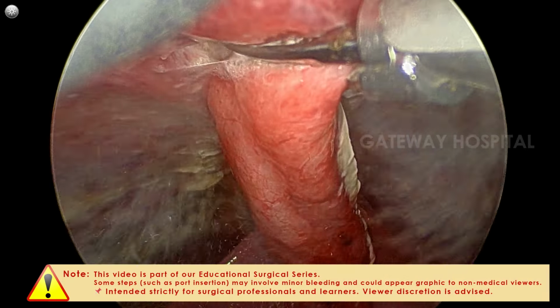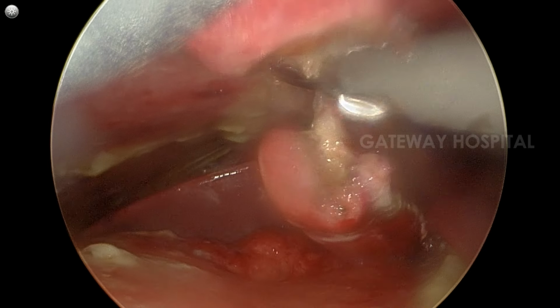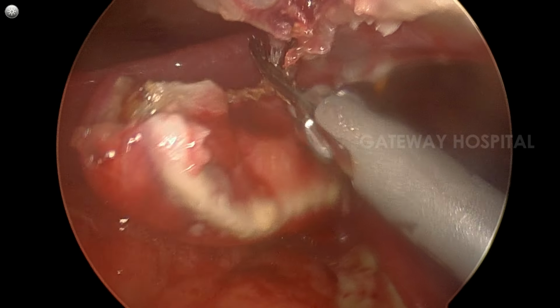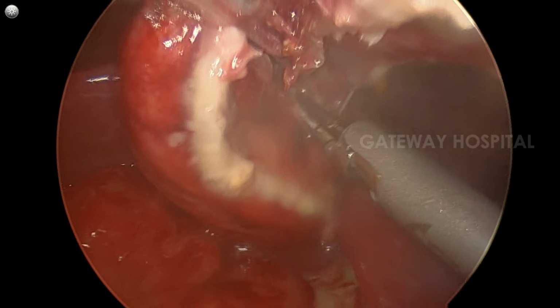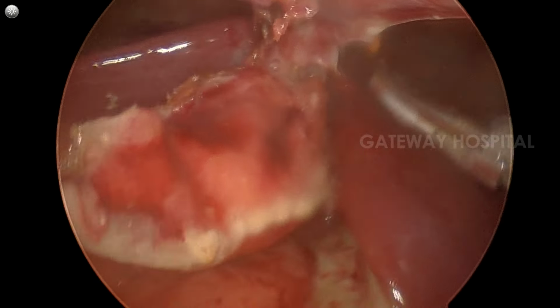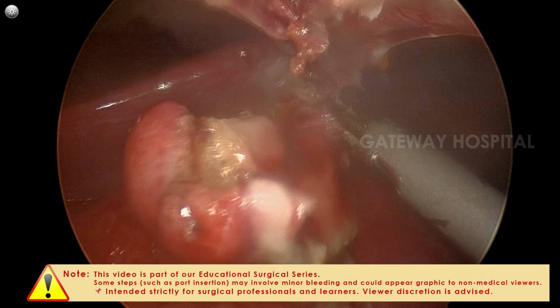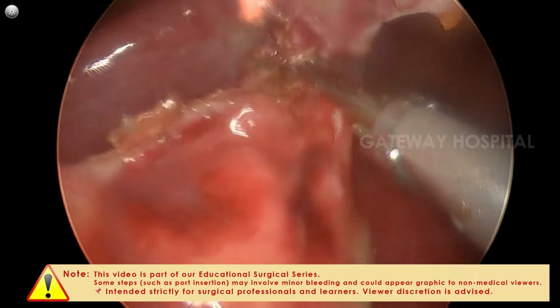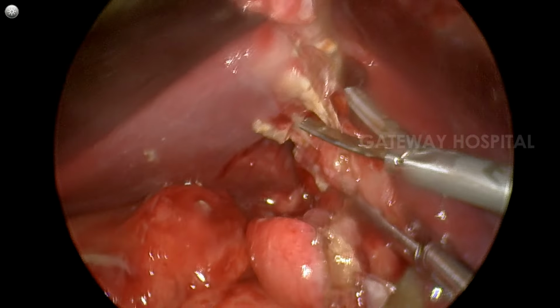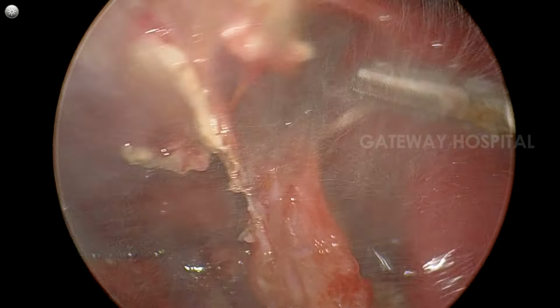Regarding the falciform ligament patch for duodenal ulcer perforation closure, we use it regularly, and we have been using it for the past 10 years at least. This is a very nice patch for duodenal closure, because as soon as you release the falciform ligament, it immediately falls over the perforated area and lies over the perforation site.